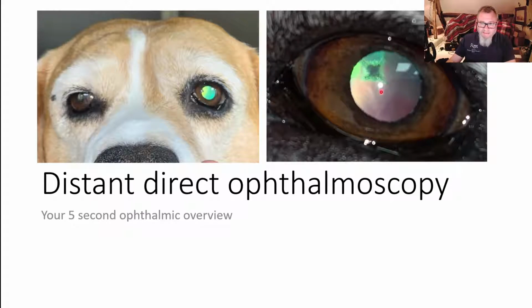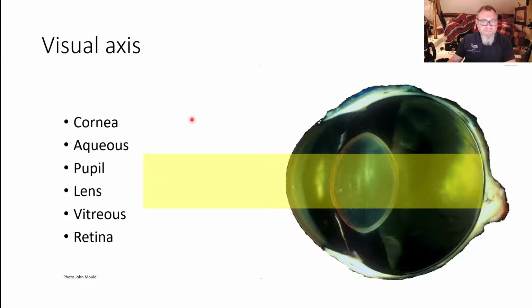When we look closer, by zooming in with our digital smartphones, we can actually see this beautiful triangular type lesion, which is a typical posterior polar subcapsular cataract in this dog. So from a distance, and that moving image, we can learn a lot about the location of our lens lesions particularly. Some concepts to help us get the hang of how this works, which we'll keep going back to, we're going to run through for you now.